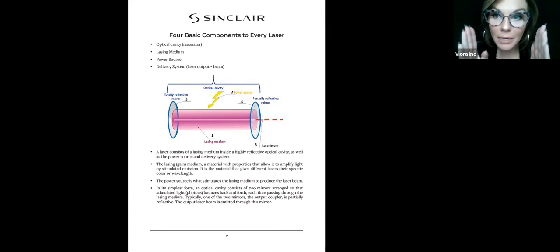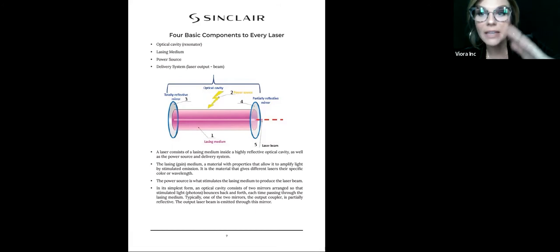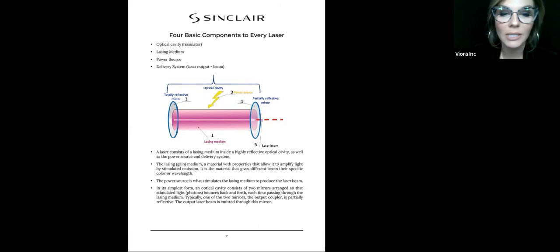And then these mirrors are really for those photons, because all of this is very excited inside the cavity. Those mirrors are for those photons to bounce back and forth, back and forth. And then the photons start to line up with one another and they start to travel in a wavelength manner. And it's the wavelength that we want because of the medium that we put inside the cavity. So they start to travel in a wave-like manner, and then out comes the laser beam. Who thought of this? I can't even believe how people's minds work to have created a laser. It's amazing.